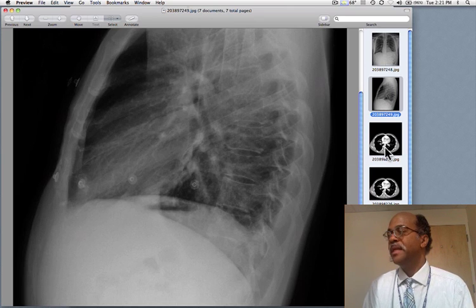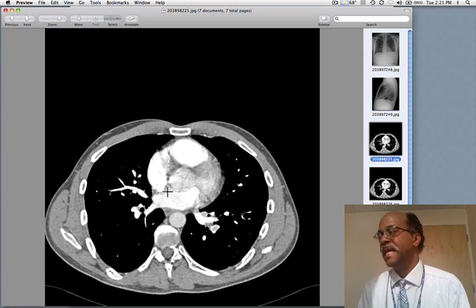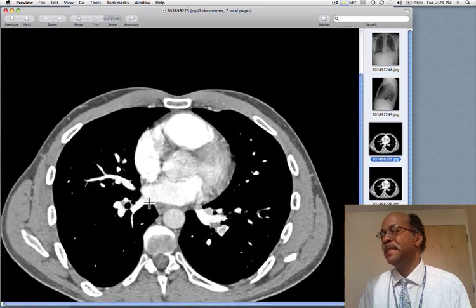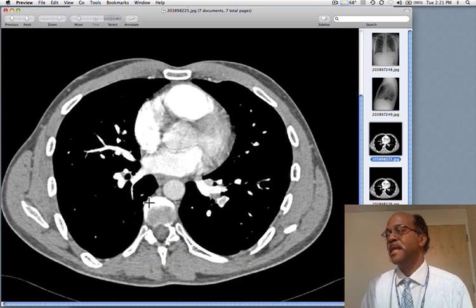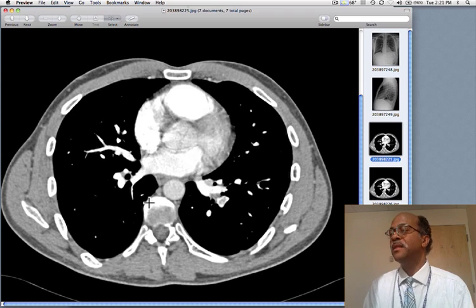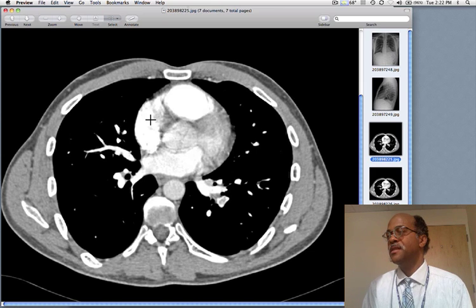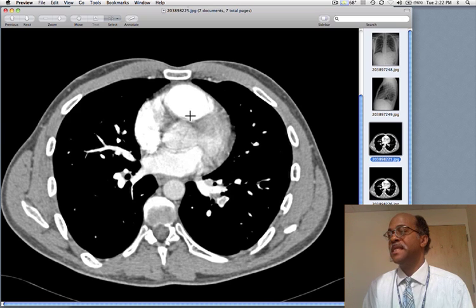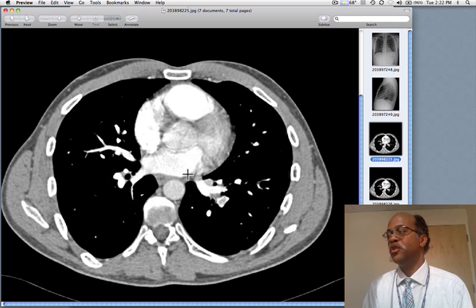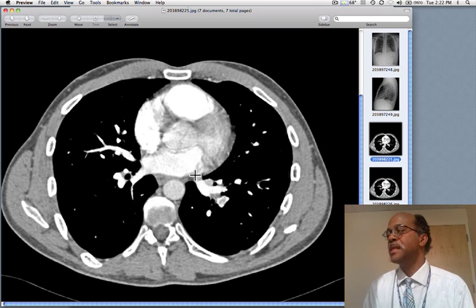We did a pulmonary embolus CT. The scan was done with intravenous iodine contrast, seen here in the right ventricle and right atrium — it's denser, of higher attenuation, than the contrast in the left atrium, because we're doing this to optimize the visualization of the pulmonary arteries.